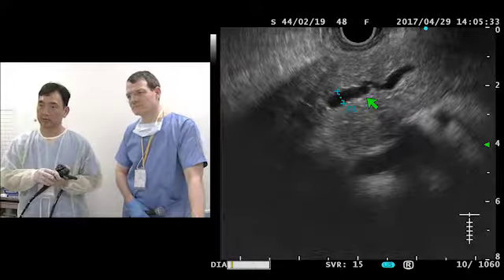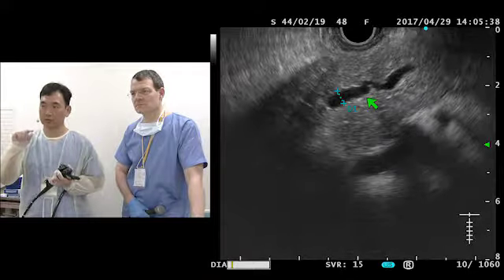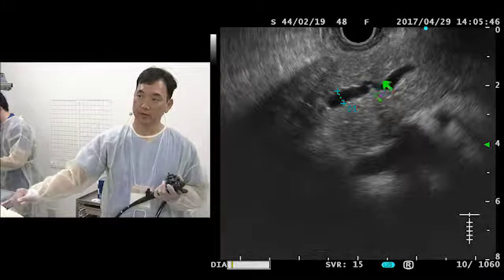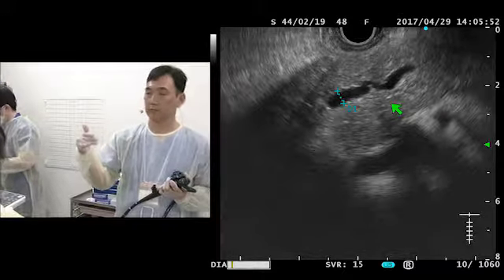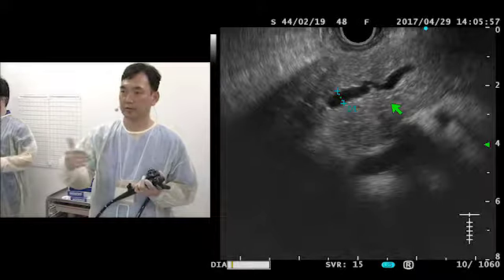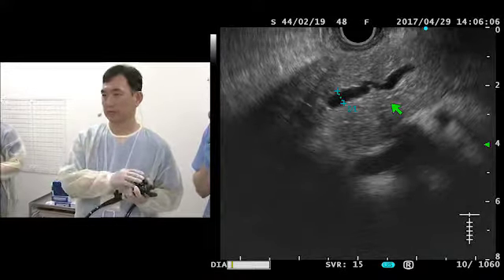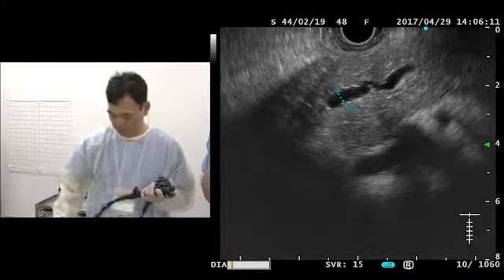The pancreas duct is much more prominently dilated, 4.7 millimeters. This must be up to 2 millimeters in a normal range. Now, Stefan has been pointing out that the ductal wall is actually a little more hyperechoic, maybe as an inflammatory change. So we are accumulating evidence that she may have changes of chronic insult, maybe getting into chronic pancreatitis, although we have not had conclusive criteria yet. So maybe chronic alcohol consumption is contributing to those changes.